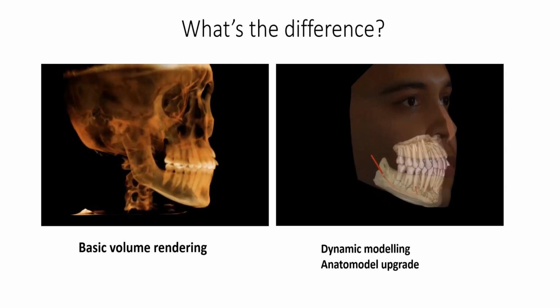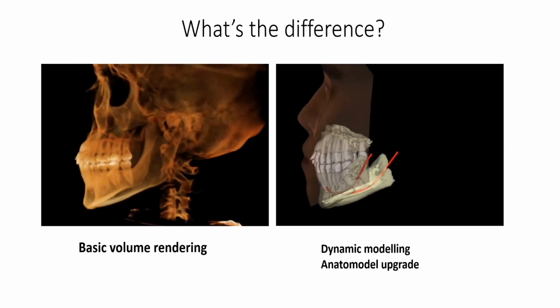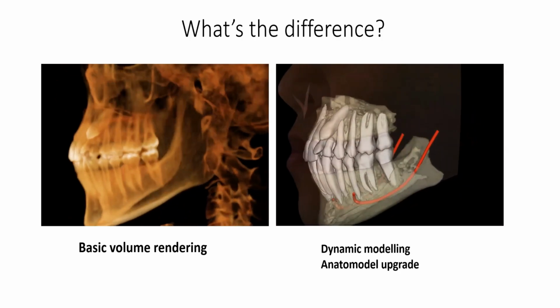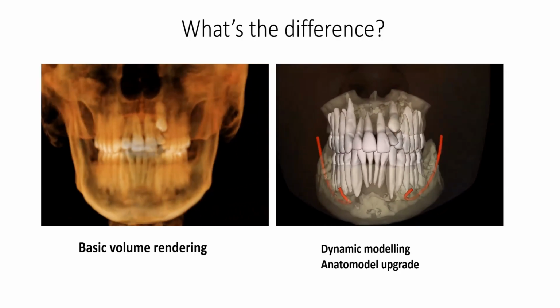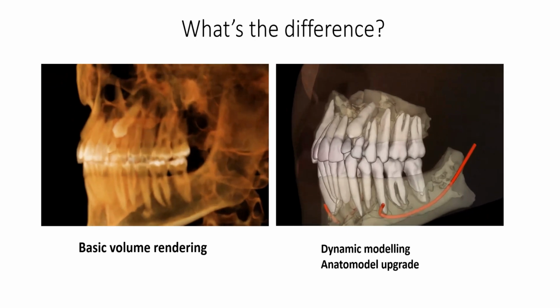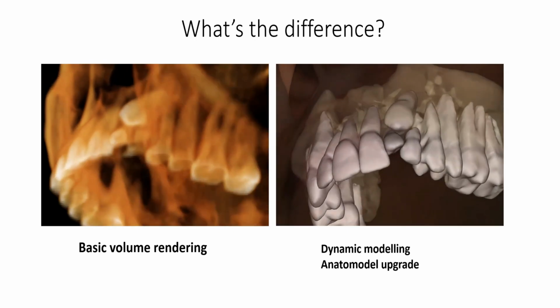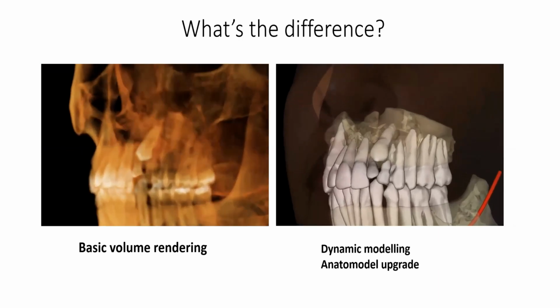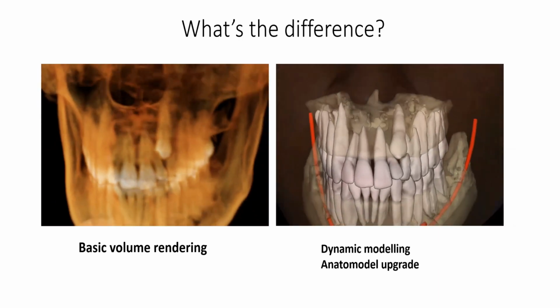presentation. Here's another example. Volume rendering. We'll go through this a little faster. Same thing, impacted canines. For those who are just getting started with this technology, impacted canines is probably the first reason people would want to do this, to really visualize and to be able to move.